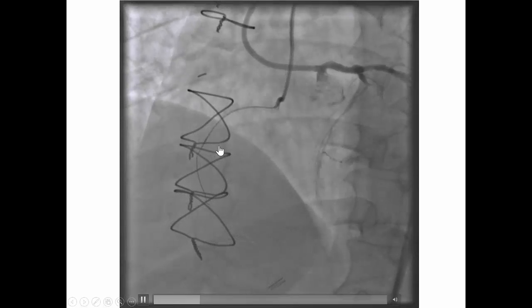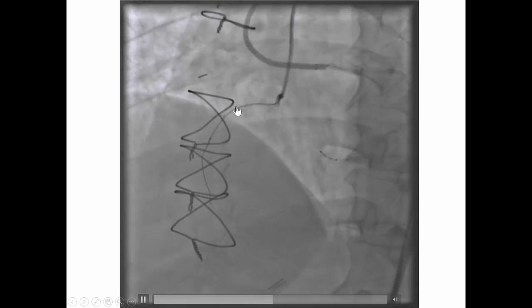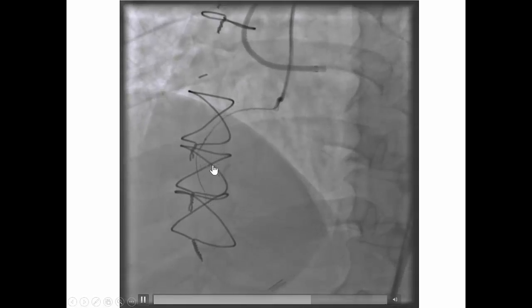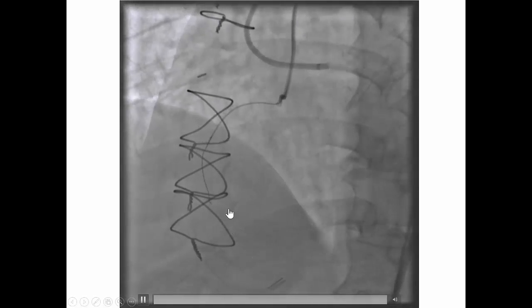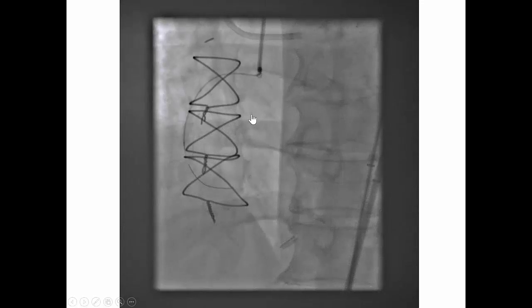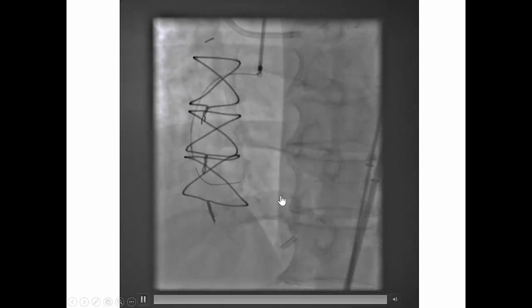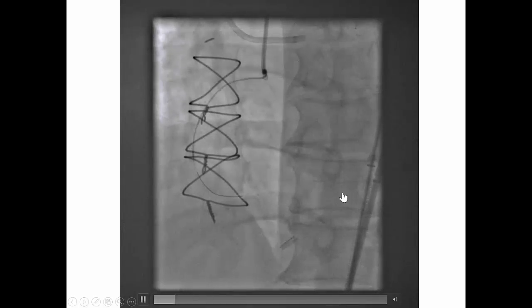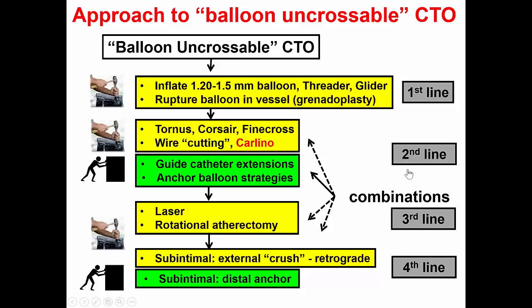And we were, to our surprise, able to advance a PILO 200 guide wire through a Corsair microcatheter all the way into the distal true vessel, as confirmed by contralateral injection. The problem was, however, that no balloon would cross the lesion. This is an example of a balloon uncrossable CTO.